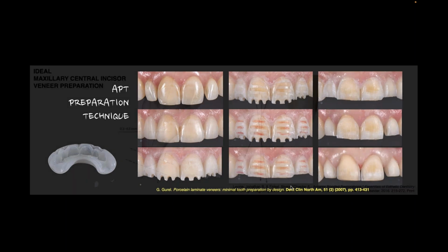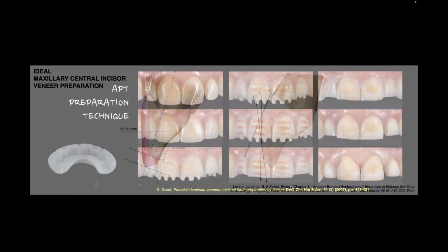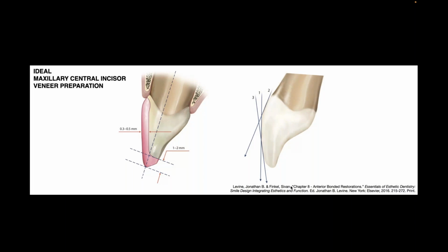Once we've done this, I want to make sure that he's provided the right amount of information for us, especially if we're going to stay in the veneer world. I have to understand, or our clinical partners have to understand, that I don't want them wrapping this veneer over to the lingual. I want them to give me more of a rounded finish line here with a finished shoulder, so a flatter surface as I round around the axial wall, and then I finish straighter across.